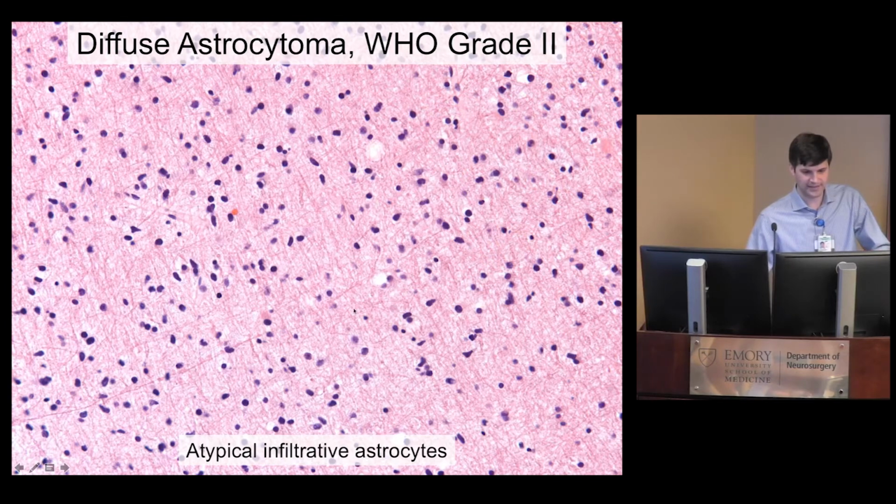So you can pretty easily see axons individually traveling through this tissue. And what has caused this neuropil to become edematous and splayed apart? Well, there's an abnormal population of astrocytic appearing nuclei here. They are hyperchromatic, they're dark, okay? And they're scattered somewhat willy-nilly through this tissue, all right?